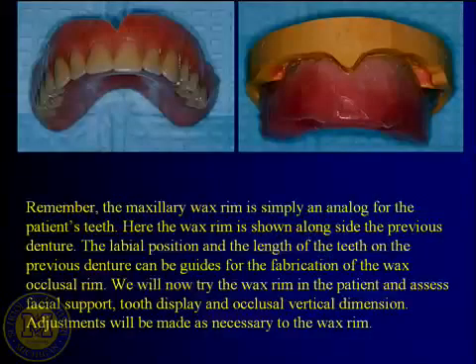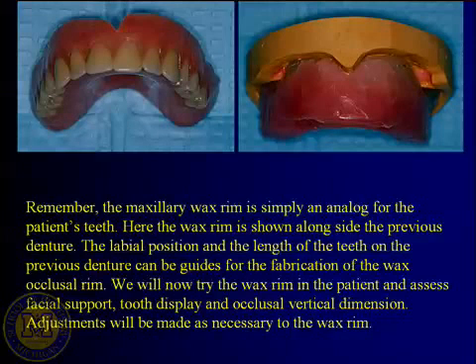What we're trying to look at is, okay, let's look at the patient's pre-existing denture. Now, for the sake of this discussion, let's say this denture that the patient's worn was an immediate placement transitional denture, worked out okay for the patient, and the patient says, I pretty much like where the teeth are on this. I like the way it supports my lip. So with the new denture that you're going to make me that's going to fit better, I'd like it if the teeth supported my lip about the same and where they were positioned up and down was pretty much all that was the same as my denture was. So how does one accomplish that?